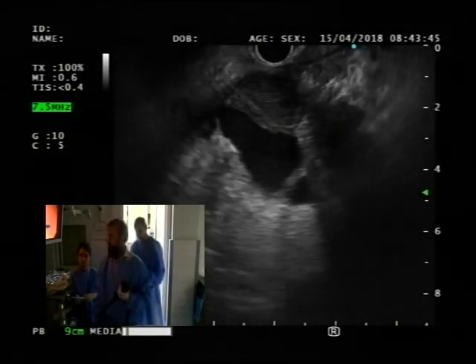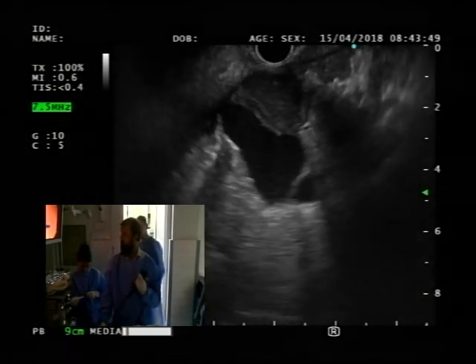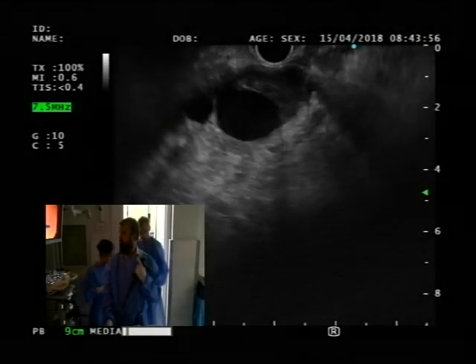All for RBCs and a single here and there, so that would be with the clot. I put money on what you were saying. अगर नहीं होता ना तो you are dead.